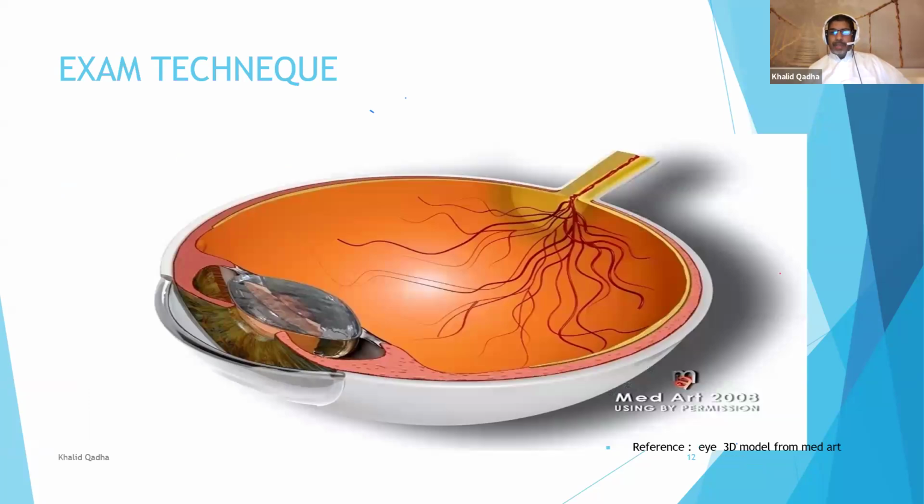So as a simple example, you can see that when you start from the posterior, from the optic nerve, and then start to slide the probe up to the anterior.